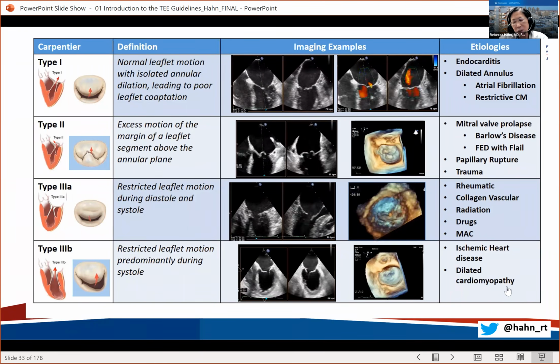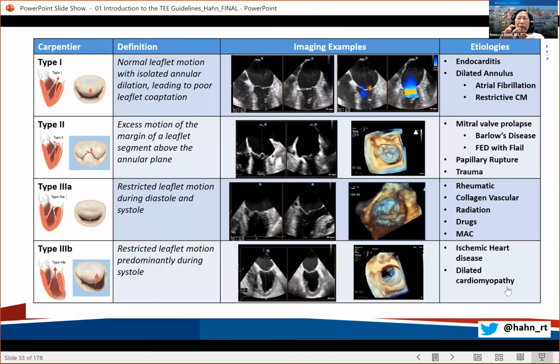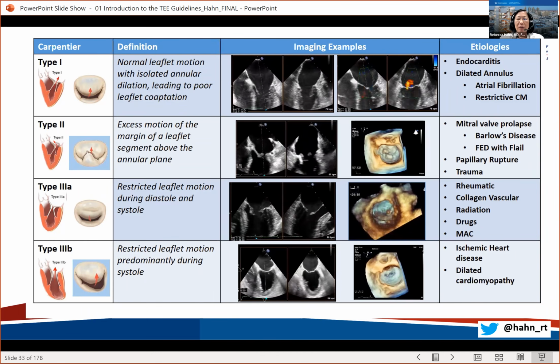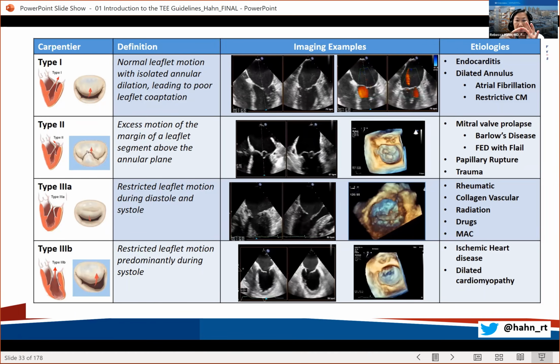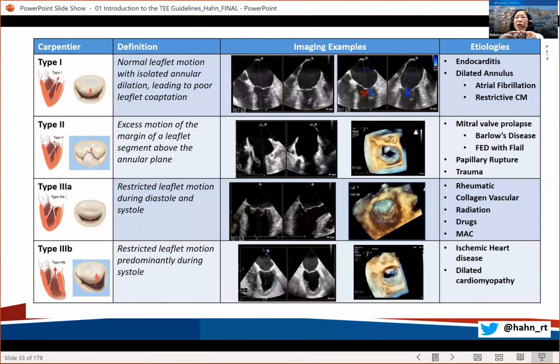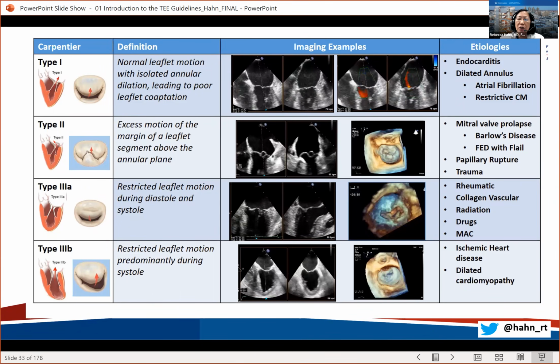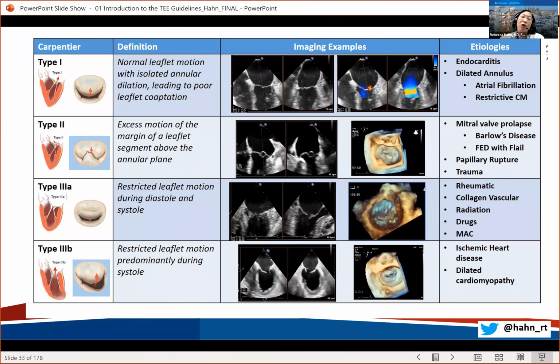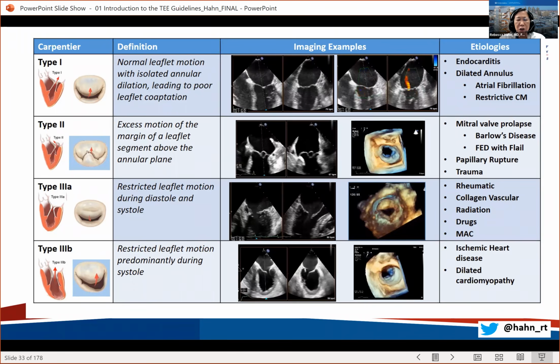So remember, I'm just going to digress for 10 seconds. When you're calculating the stroke volume across something, you're going to have an area and then you're going to multiply it by the distance that the blood travels across that area. And therefore, what we use is going to be a planar structure. And we're going to have typically a circle, or it could be an oval, whatever; three-dimensionally, you can also trace it, but it's going to be planar, because then you're going to put the sample volume at the same level that you measured, and you're going to get the velocity time integral at that location. And the velocity time integral in meters or centimeters is the distance that the column of blood moved in a single beat. So now you got the volume, the stroke volume, right? So you got area times distance equals volume. And that's why we use planar structures in order to calculate the area.